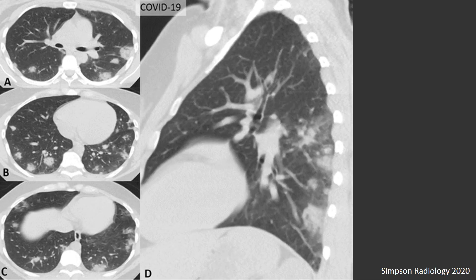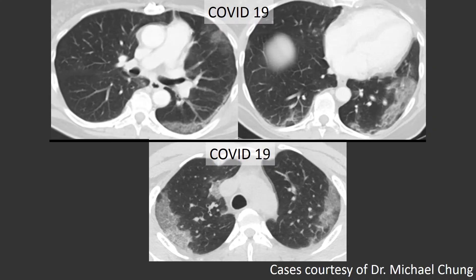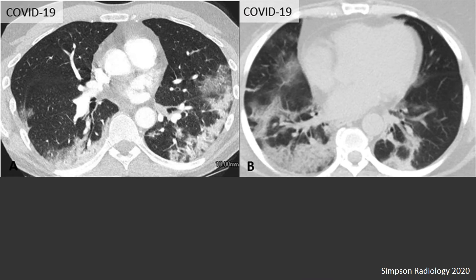Another person with typical features demonstrating multiple bilateral peripherally oriented opacities, which appear somewhat rounded in morphology. This was a case of mainly consolidation with a small amount of ground glass. Opacities do not necessarily have to be rounded — they could just be peripheral, with predominantly ground glass opacities located in the outer edges of the lung, some demonstrating visible intralobular lines consistent with crazy paving. Additional cases show peripheral opacities of mixed density — both consolidation and ground glass — with the central aspects of the lung spared.